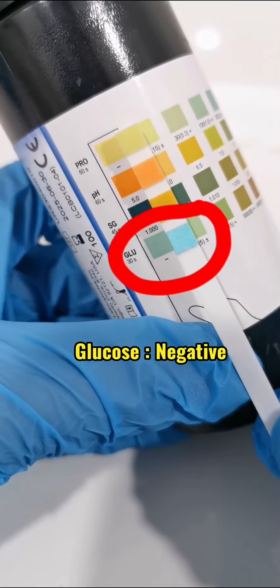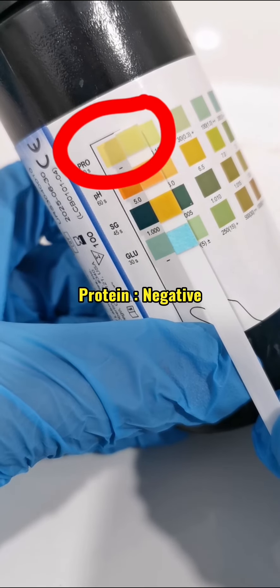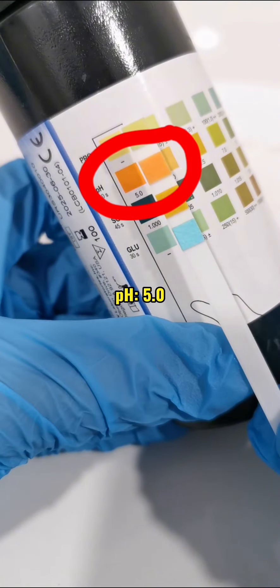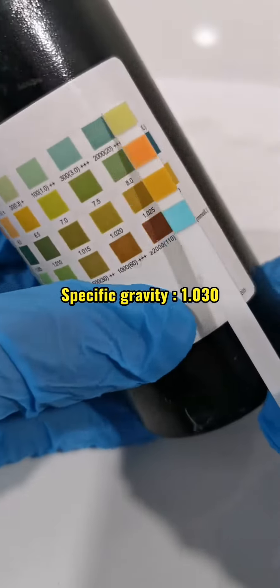Compare the strip to the chart. Glucose: negative. Protein: negative. pH: 5.0. Specific gravity: 1.030.